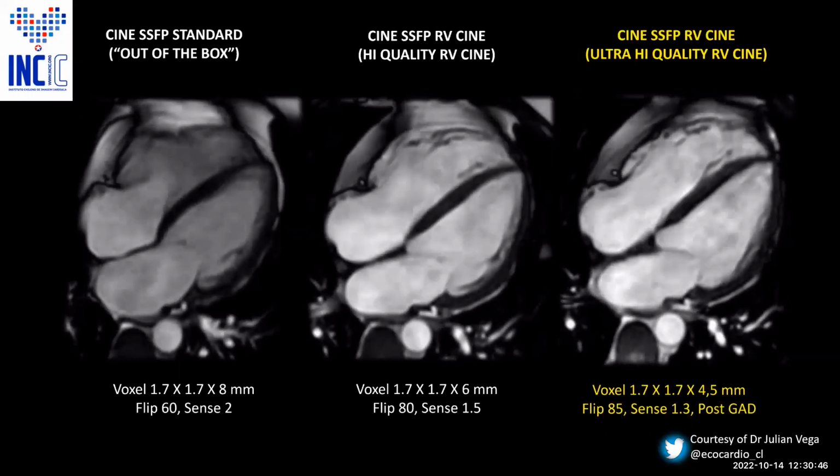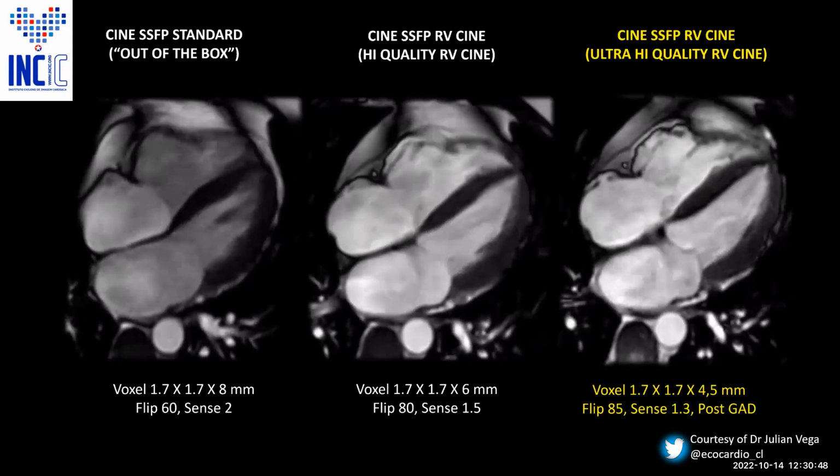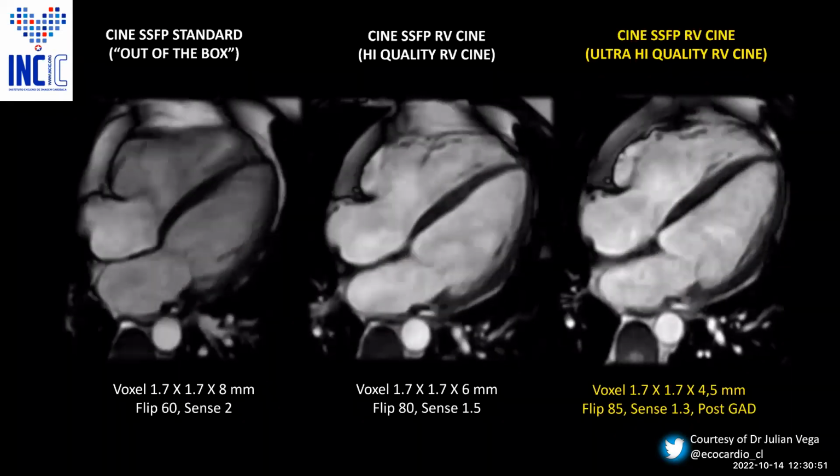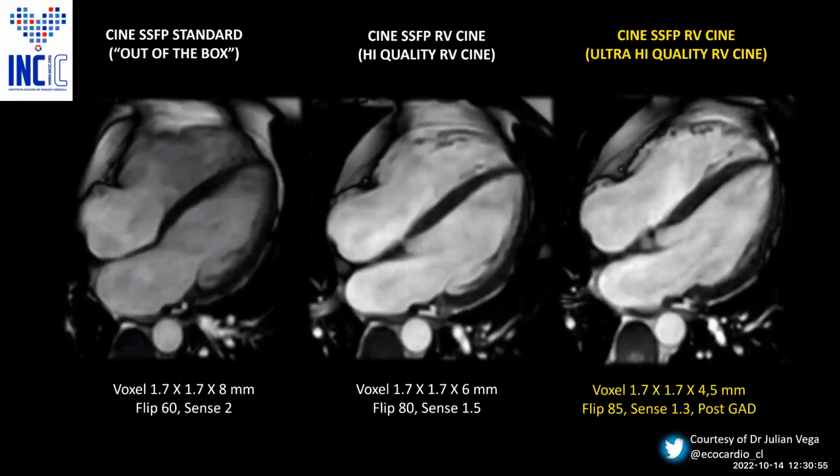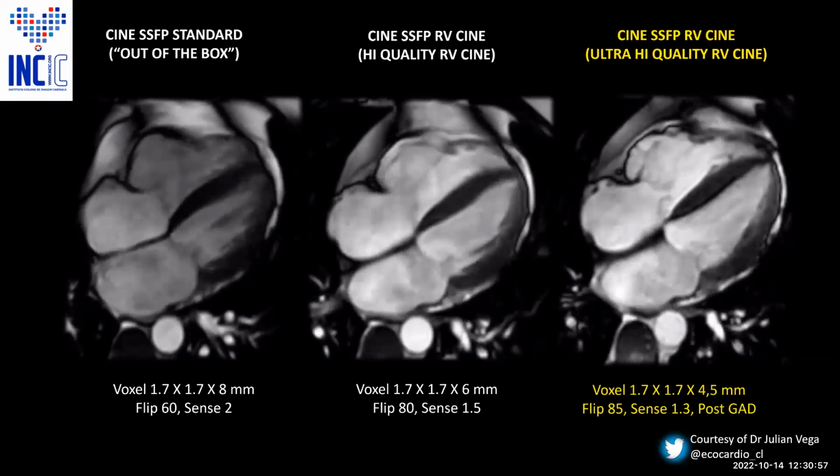And if you want to push further the limit of spatial resolution, you can adjust the imaging settings to acquire high-quality cine sequences after the contrast for improving the signal-to-noise ratio.